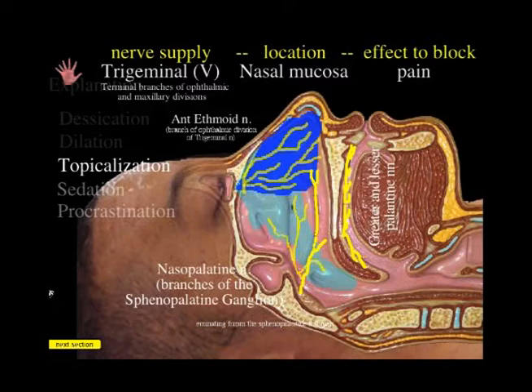So by working on the nose, we're already getting the pharynx. It's okay, we're waiting for our glycopyrrolate to work, we're waiting for our desiccant to work, so why not? Why not go for the nose?